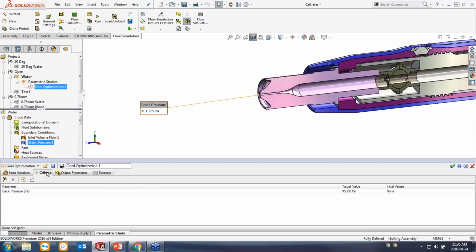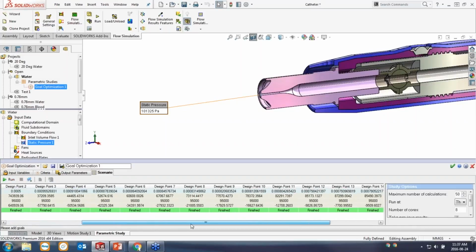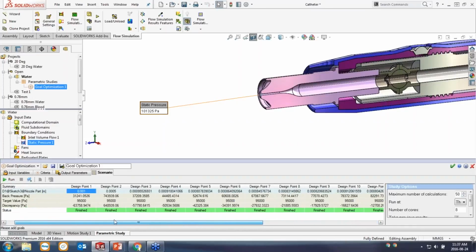We know that our back pressure was way too high. It's near 700,000 pascals, and we want it to be less than 100,000. So I set this as my parameter, and I gave it a target value just under 100,000, 95,000 pascals, and I told it to tweak that diameter until it reached that. And then I hit run, and I did this last night before I went home, because it goes through and it runs the study multiple times. So it tries out 1 millimeter, half a millimeter, and then it starts nailing in on values in between.